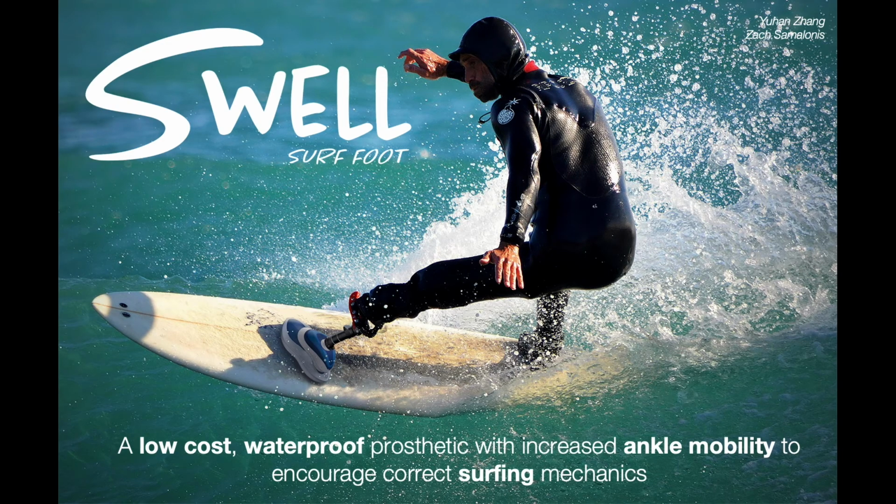and this is the Swell Surf Foot, a low-cost, waterproof prosthetic with increased ankle mobility to encourage correct surfing mechanics.